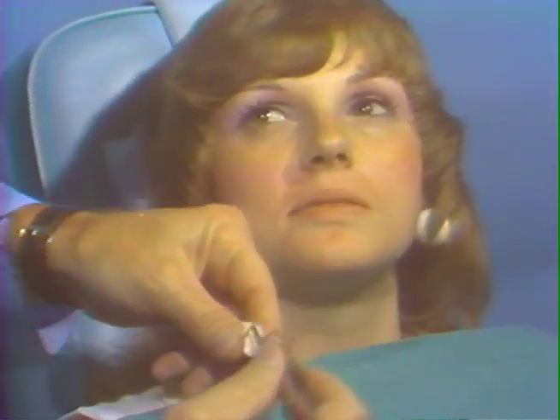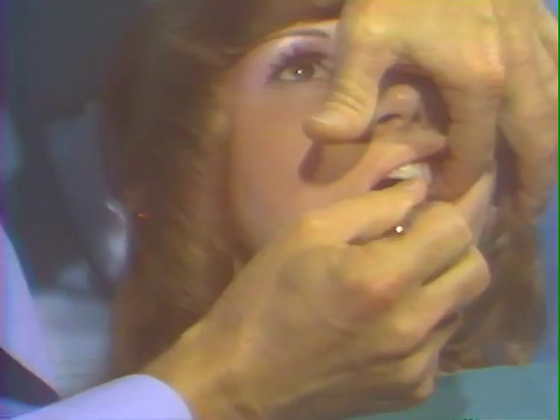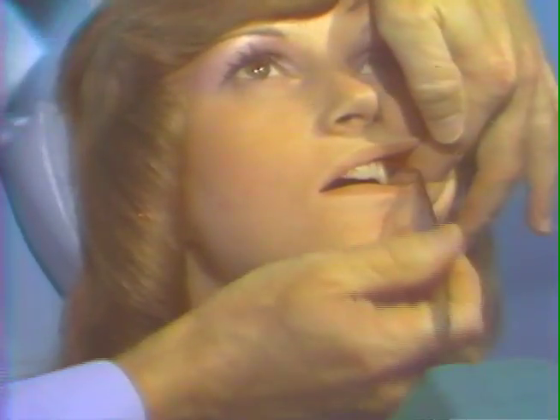To utilize the cotton roll for topical analgesia of the inferior alveolar nerve left and lingual nerve left, place in this manner. Now open your mouth wide. Let me pull your cheek. That's it. Don't turn your head. Bite down now. That's the way.